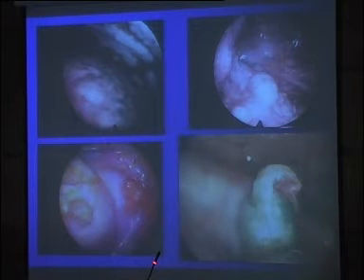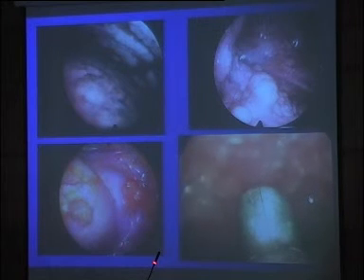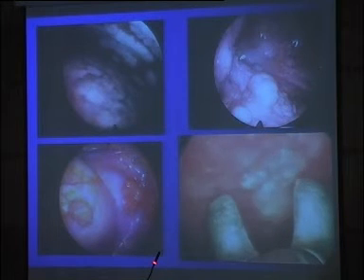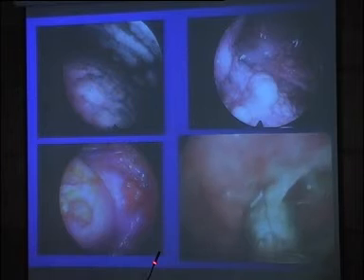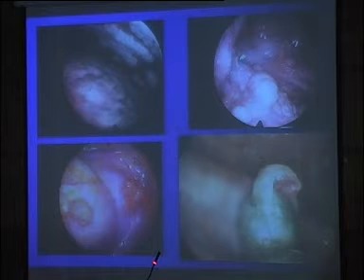Sorry. Come close. Here you have the rib when I peel. Look at this. This white bundle is a rib. You see it? You can believe me, it's a rib. I can tell you.